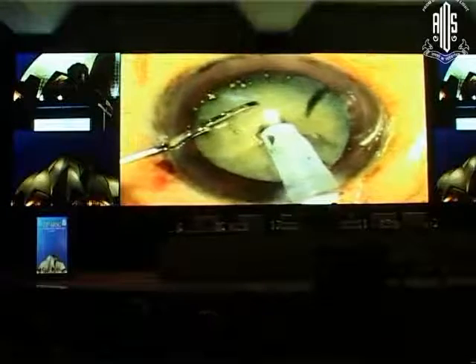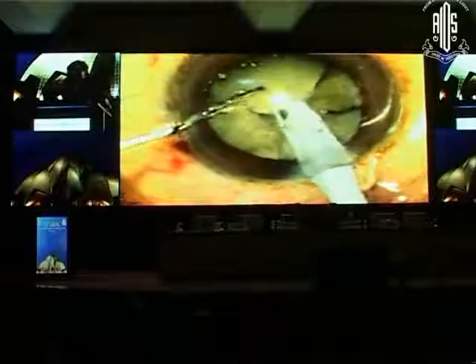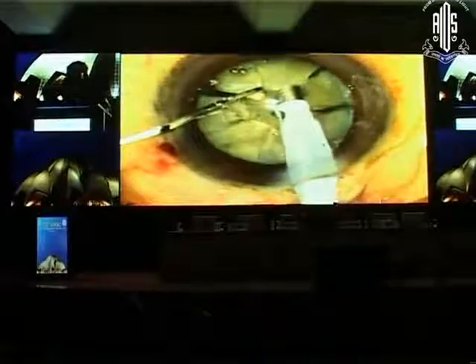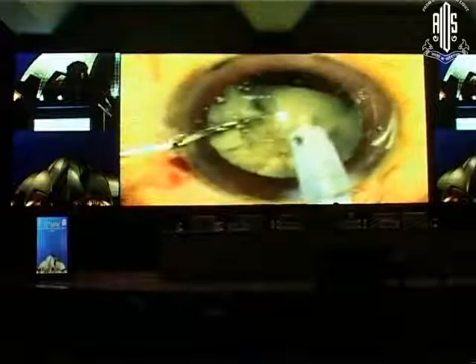So this is a technique by which you are rotating the nucleus, making small pieces, keeping the pieces to the side. And the piece has to separate from the posterior plate, which also has to separate, but without any untoward movements. If you're not rotating the nucleus in the same plane, trying to rotate it in any other way, the pieces will wobble against each other, and one of the sharp pieces will tear the posterior capsule. So rotation in the same plane, complete separation of the pieces in such a way that the posterior plate also separates. Now you start emulsifying one piece by one.